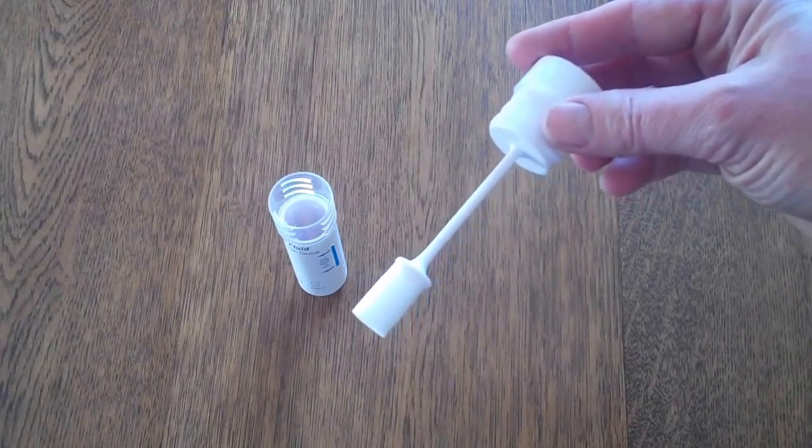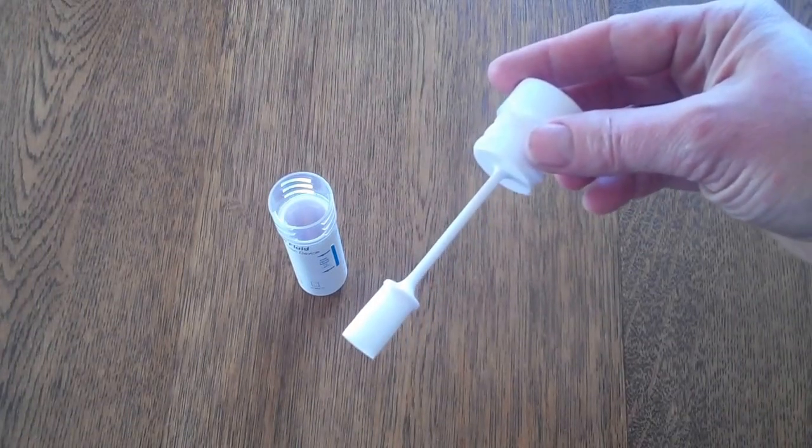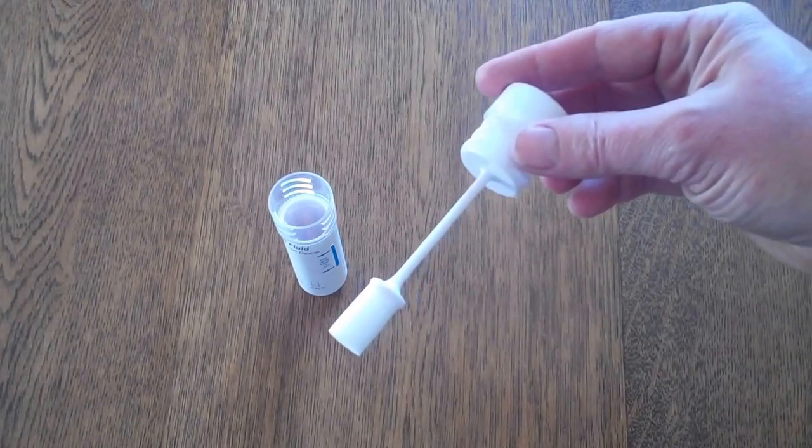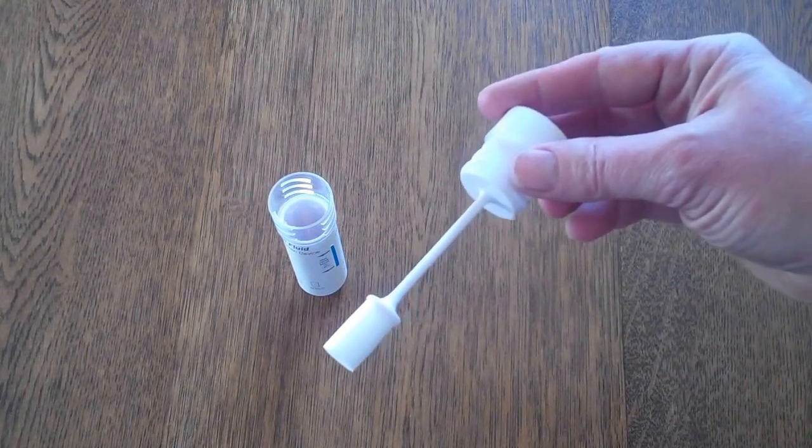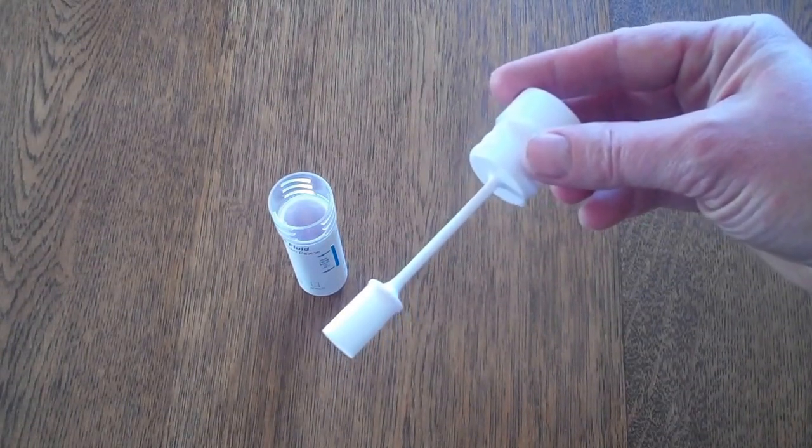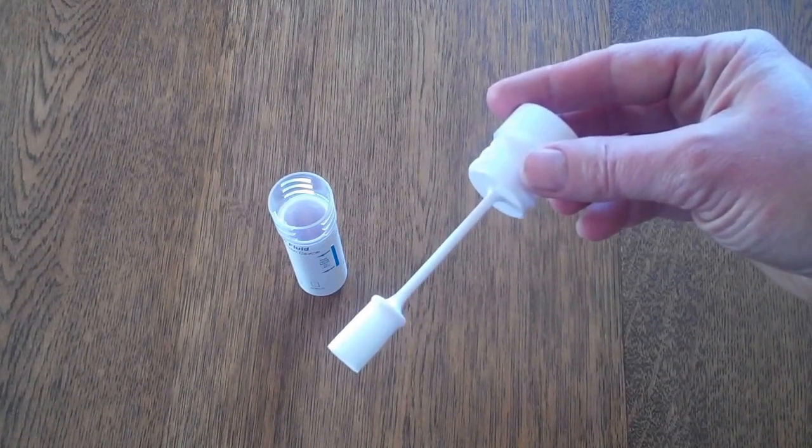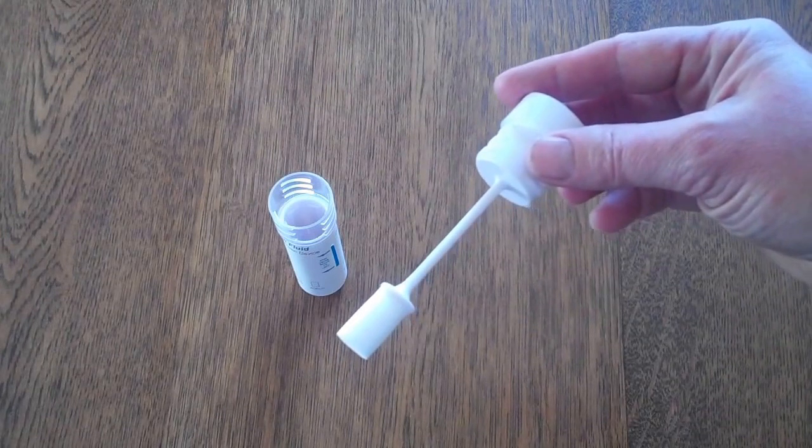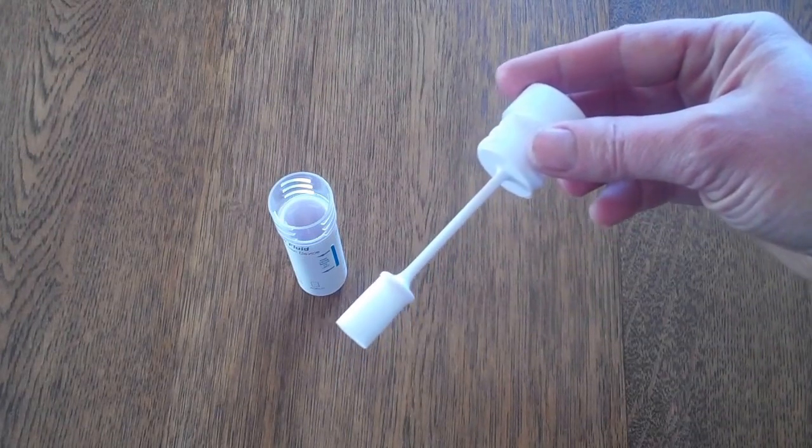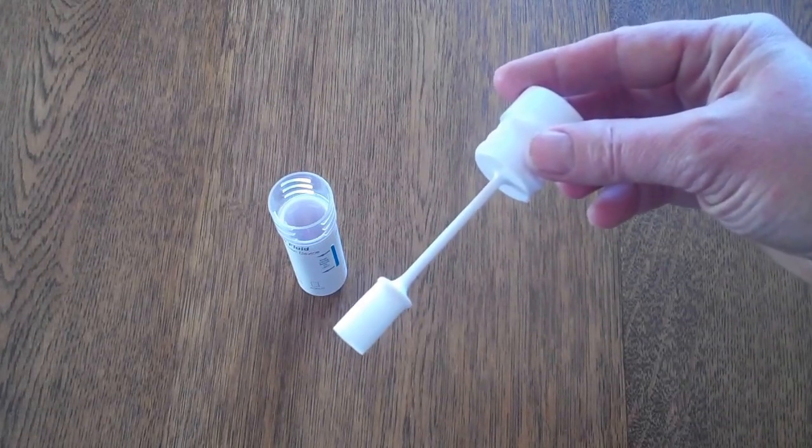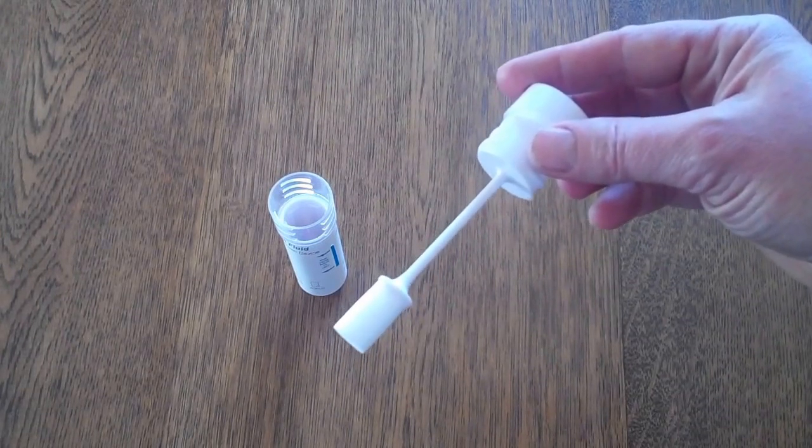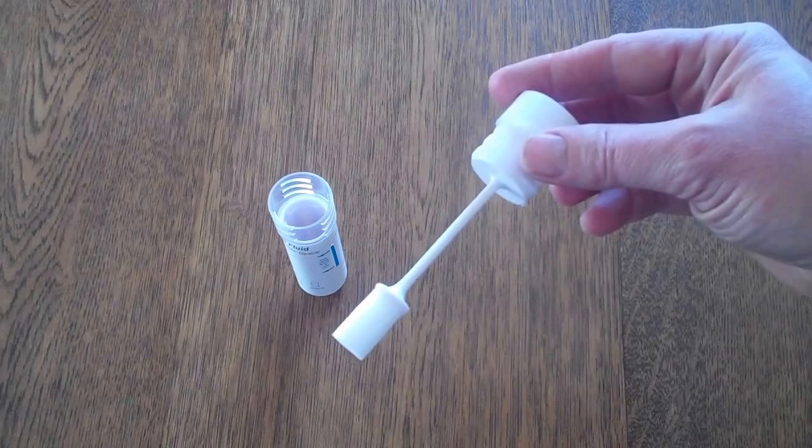The good indication of when a sufficient sample is being collected is that the swab will go completely soft and sponge-like and at that stage it should have ample saliva absorbed into it to perform all six tests.